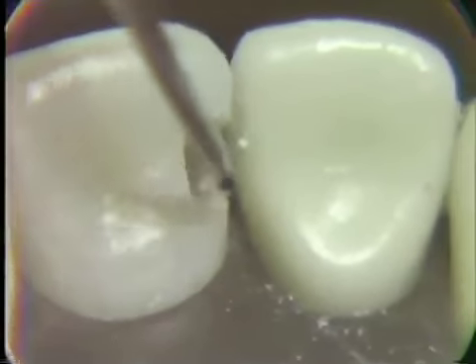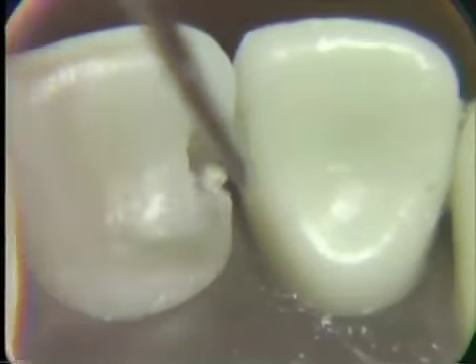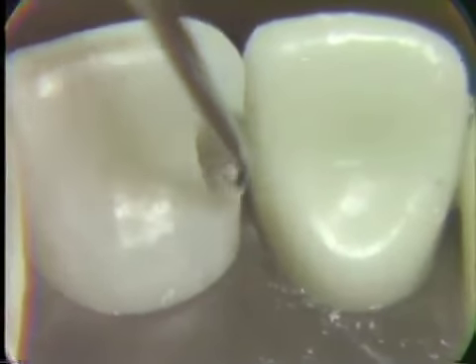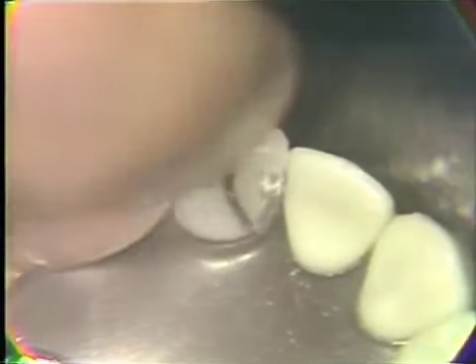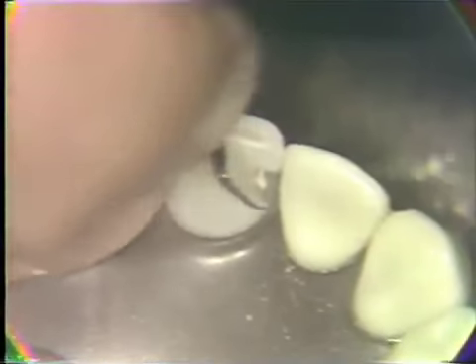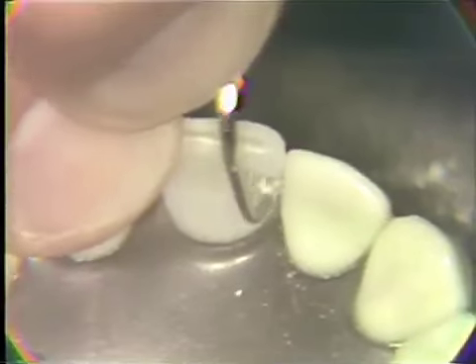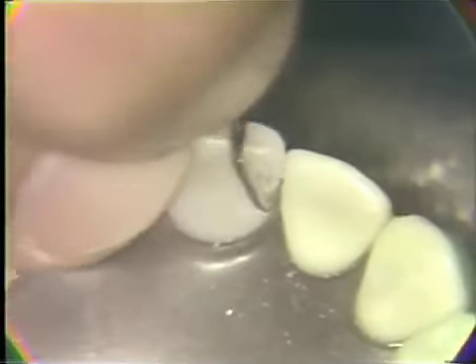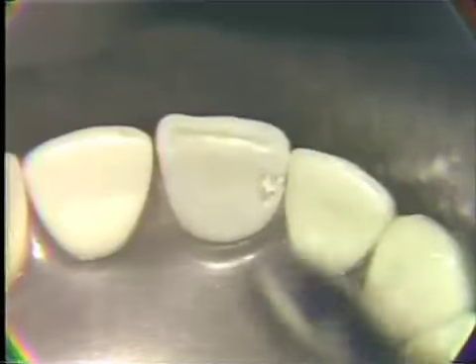And if we so need to extend and smoothen that wall with rotary instruments, we might do that with a low-speed contra-angle and a 33.5 inverted cone burr. Here I don't see the particular need to carry out that type of smoothing action. Again, the hatchet being used here to plane the respective enamel walls, gain smoothness to the preparation.